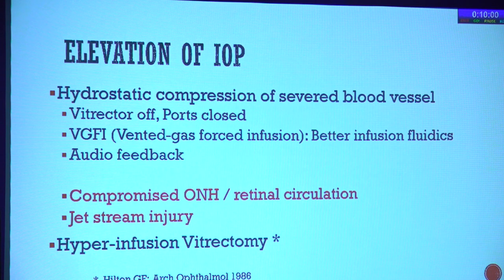There are certain authors who believe in hyperinfusion vitrectomy. They increase the IOP to 80 to 100 or even more, and even up to 10 minutes. They found that their results, anatomical and functional results, were better than the historical controls that they had, and it is published.